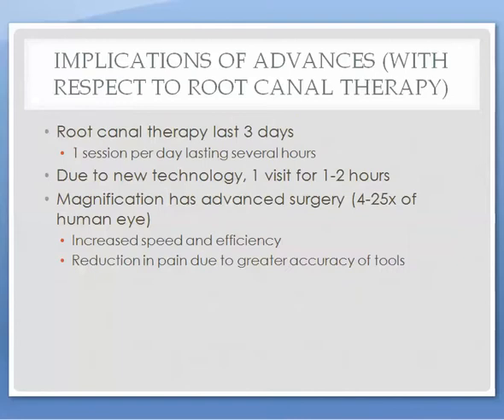Due to advances in visual aids, root canals have gone from being a 3-day procedure to a 1-day, 1 to 2 hour visit. This can be attributed primarily to tools that allow magnification 4 to 25 times the human eye. This has resulted in increased speed and efficiency of the endodontist in respect to more precise motions and fewer errors. In addition, the patient benefits from less pain occurring.